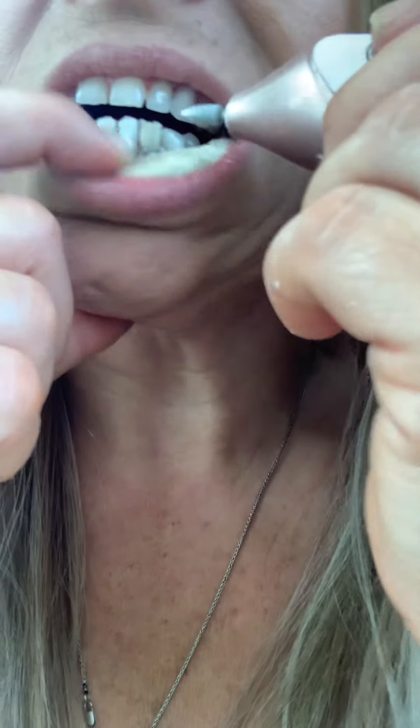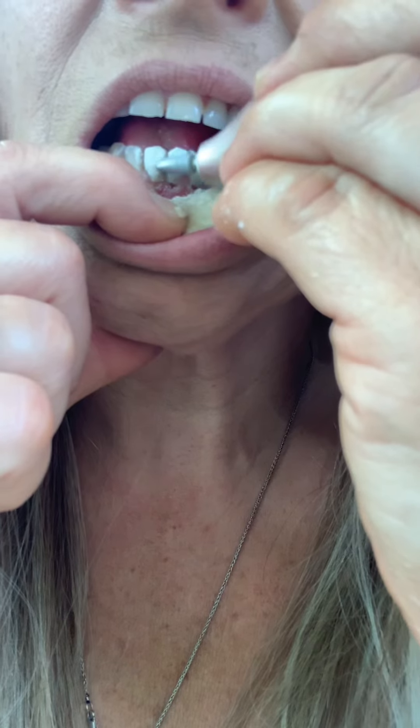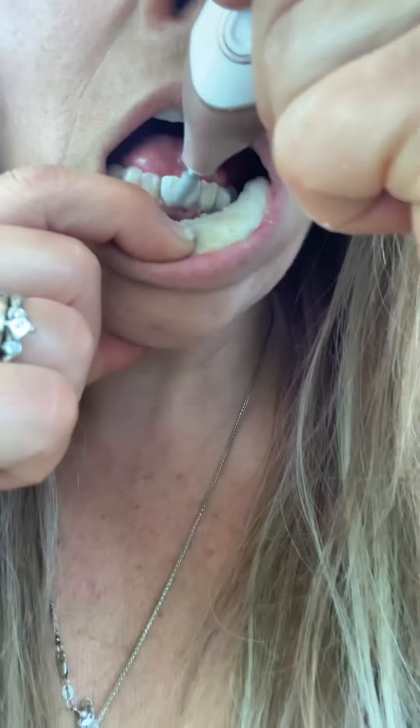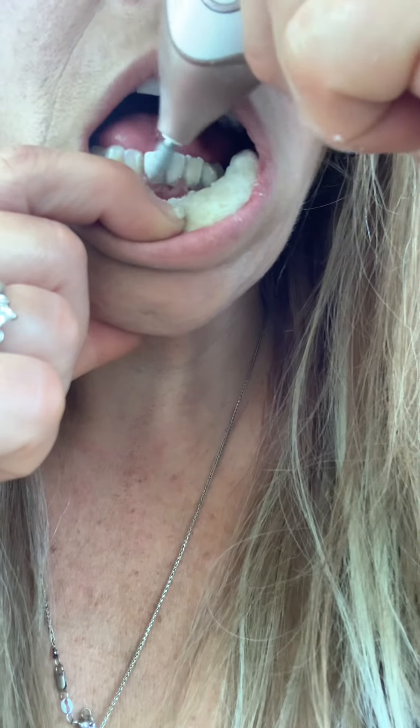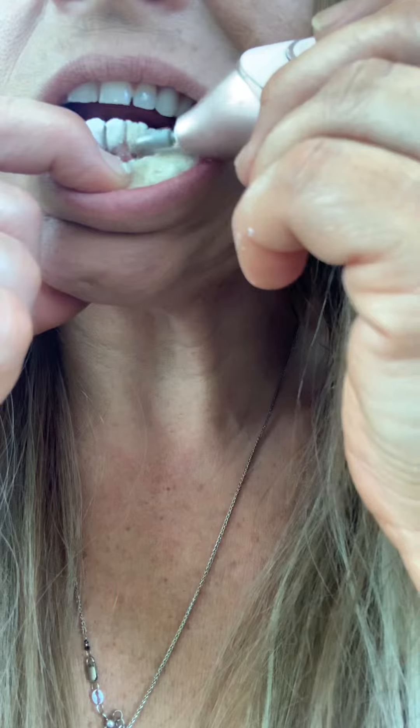But that's alright, I'm going to go ahead and work on it. I found that tip was right here.